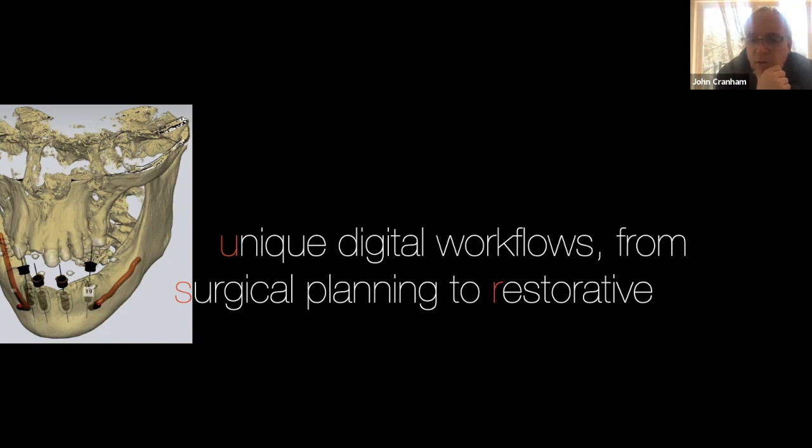And this is one thing that I haven't run into yet. Lee talked a little bit about using some of the norms and some of the skeletal landmarks to determine some of these things. I was really skeptical going into this because I always started with a record base, then I would do wax rims, then I would set the anterior six teeth and the lower anterior teeth and get the teeth where I wanted it, and then set my vertical. There are all these things that we did because that's classically what we're trained. And Lee's doing a lot of this on the articulator from these norms.